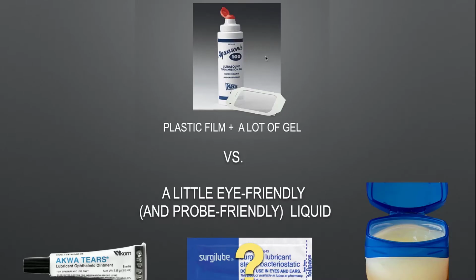In order to set up the patient, we want to make sure that we're protecting their eye, but still using something that can break that air barrier between the probe and the eyelid itself. Typically, we start with using a plastic film and lots of gel. The challenge with this is that sometimes we get air trapped under that plastic film, so people use a lot of other things instead. If you have access to it, then I highly recommend just some lubricating ointment, which is basically just really thick liquid or really thick water, which is approved for eyes, and it's what we use in patients who have Bell's palsy, who can't close their eyes at night. They use them to keep their eye lubricated.